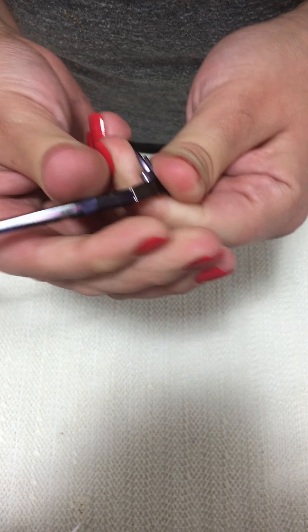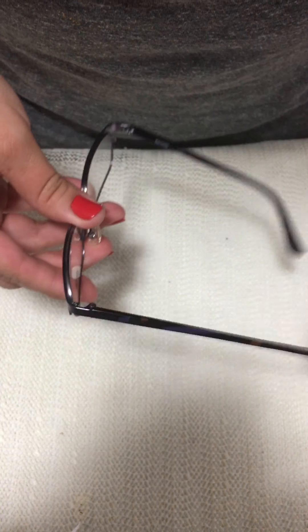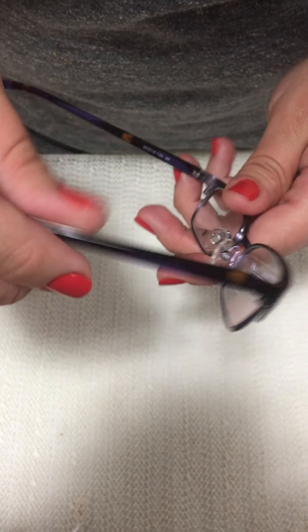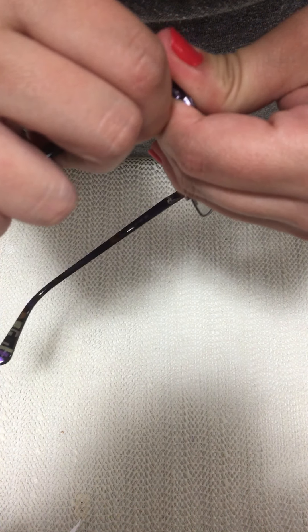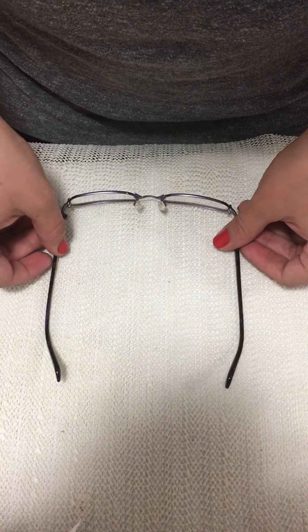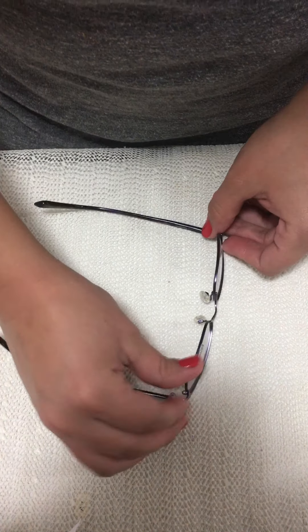I can also use my fingers to do this — it does put a little pressure on your fingers. Now that looks a lot better; it still has pantoscopic tilt but not as much. This is the side we just did, and the other side looks quite different, so I'll do the same thing to that side — push it a little bit up. Now it's looking a lot better and everything checks out.